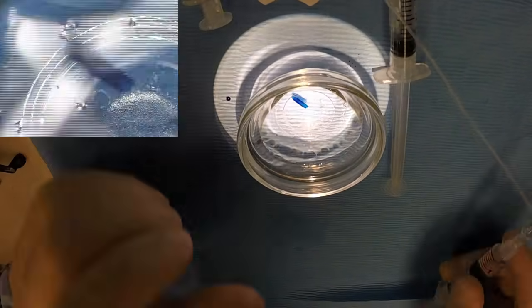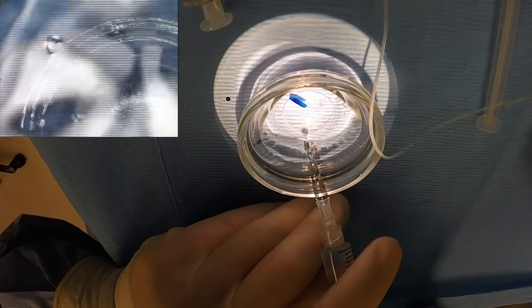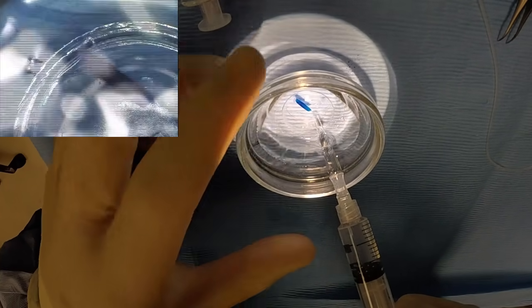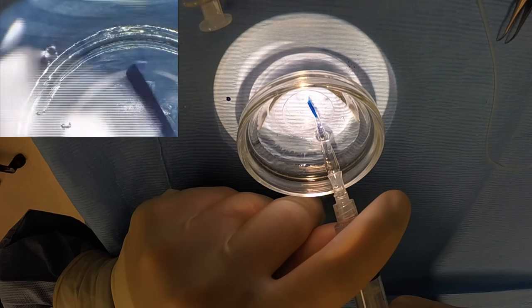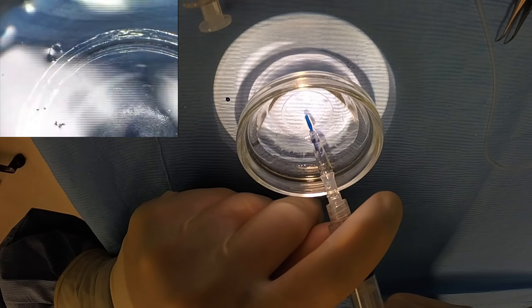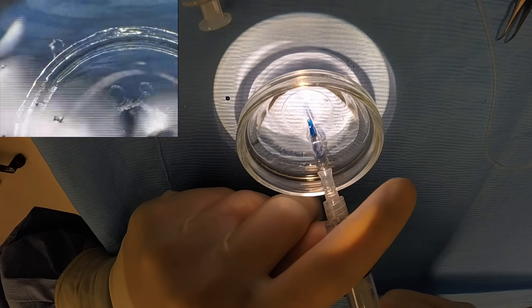I take very carefully with the tip of the Jones tube, orient the graft so it's parallel to the tip of the tube, and then just with a gentle sucking motion, pull back on the plunger, and the graft slides right back very nicely. I have very exquisite control here.